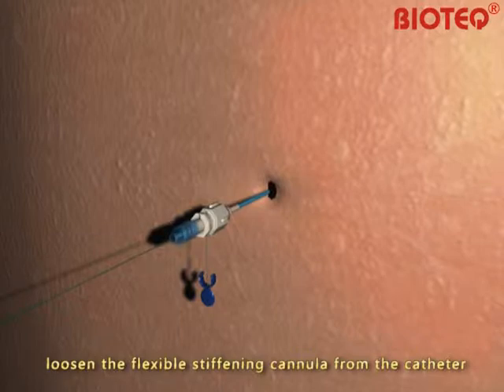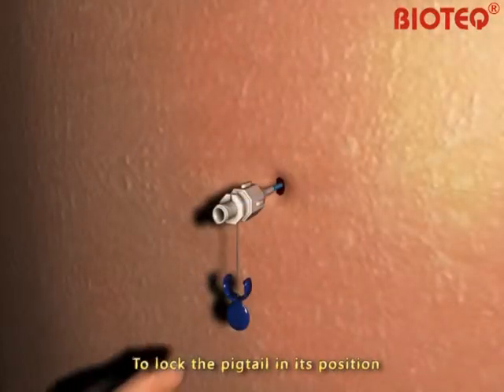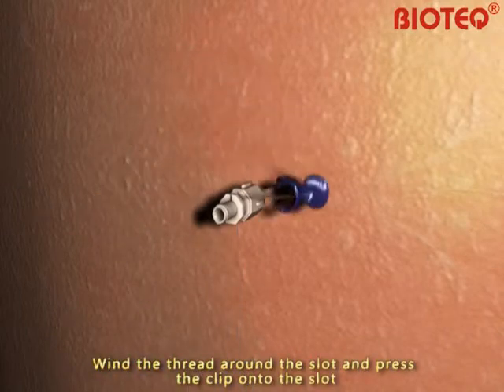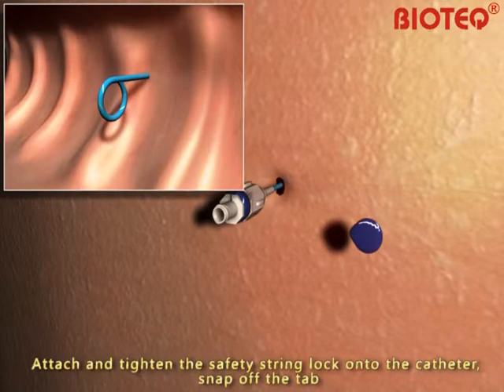Loosen the flexible stiffening cannula from the catheter. Remove the 0.035-inch guide wire and the flexible stiffening cannula together to lock the pigtail in its position. Pull the thread gently, ensuring that the pigtail tip is within the desired location. Wind the thread around the slot and press the clip onto the slot. The thread must be stretched during the process.